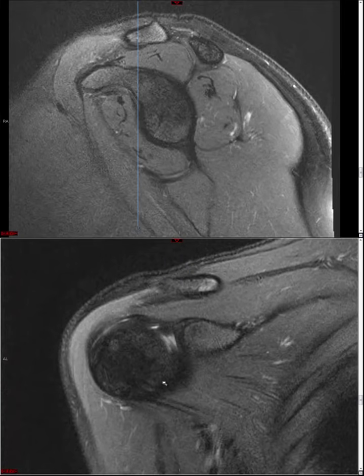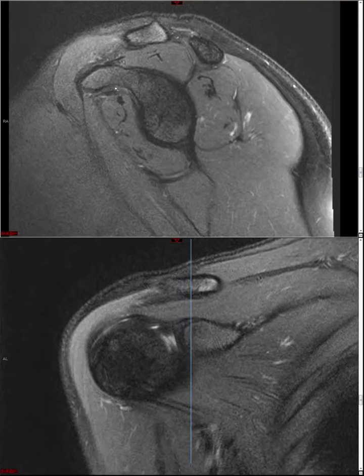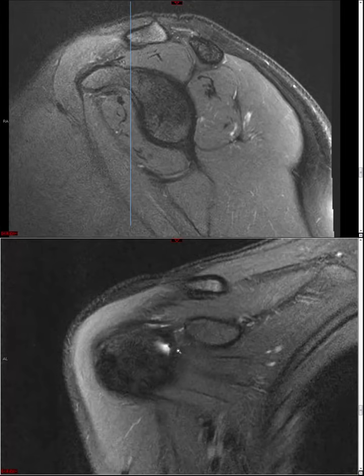So let's say you put your needle down, you're doing an arthrogram, and you see contrast squirting out, and you watch it go up and then under the coracoid process. That is actually fluid in your subscapularis recess. It's intraarticular. That's a great sign. If you're doing an MR arthrogram at that point, then you tell the tech to capture that image and you inject the GAD, and then you're going to be done really soon. So that's a really good sign.